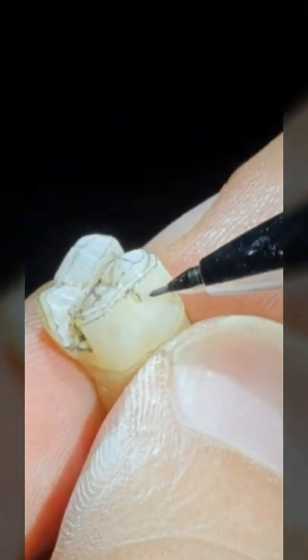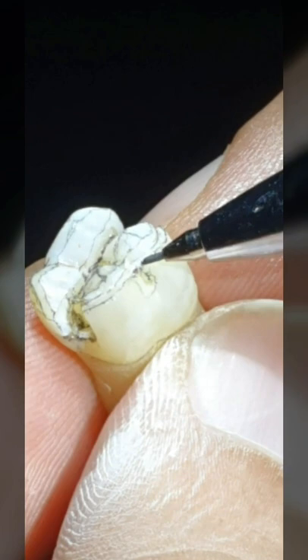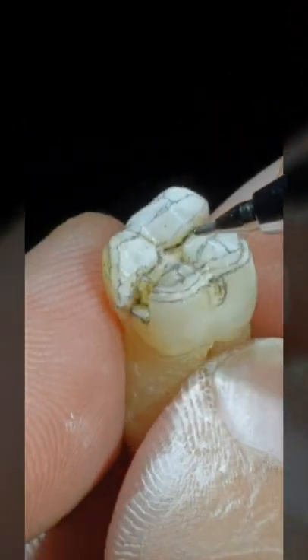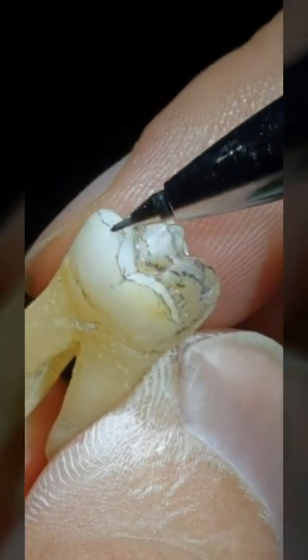A second modification comes in if there's a buccal pit, then you want to dip down into the buccal pit also. Here we're not doing that because later on I want to use this tooth for a partial coverage crown, but this is the difference that you're looking at. So now I'm going to modify the lingual also to allow for a non-metallic restoration.